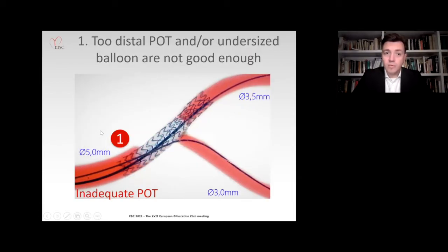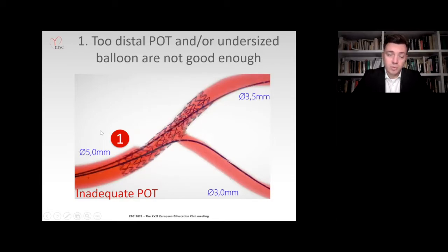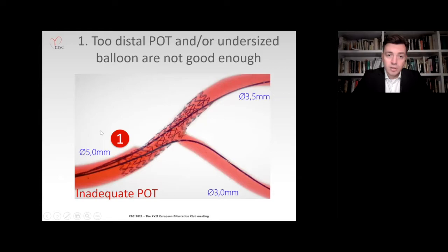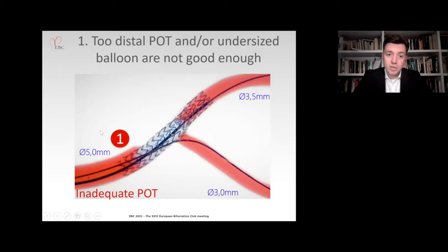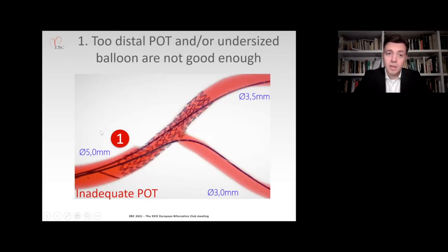To avoid or circumvent this, you can perform POT and all is good. However, POT being a technique needs to be performed correctly. If you perform it too distally, as you can see on this example, or with an undersized balloon, it leaves you at the proximal edge of the stent with the very same result as not performing POT at all. The wire still can go behind the struts, and you can still have abluminal rewiring, even though you think that you have performed POT. It was not performed correctly, and it leaves the proximal part of the stent still not expanded well with a large area of malapposition.